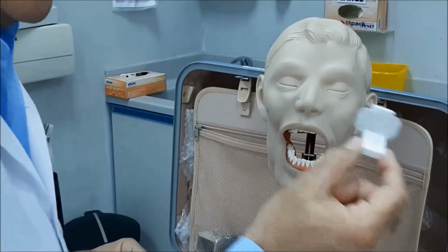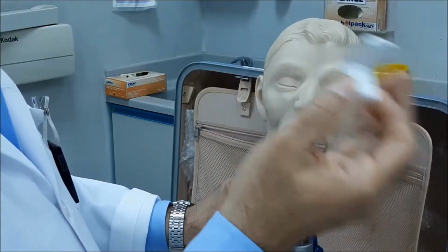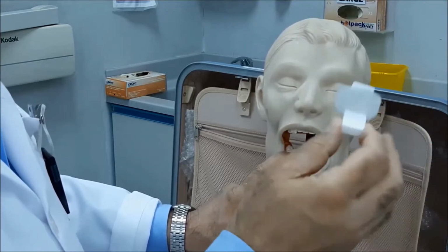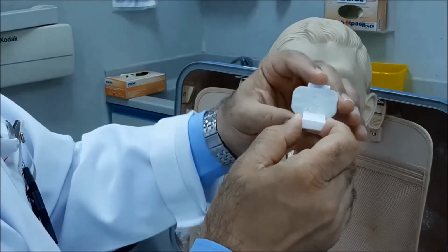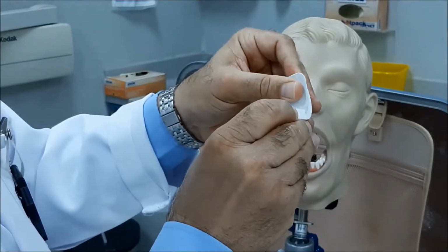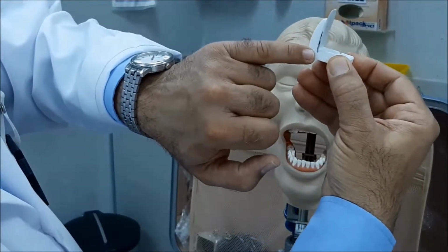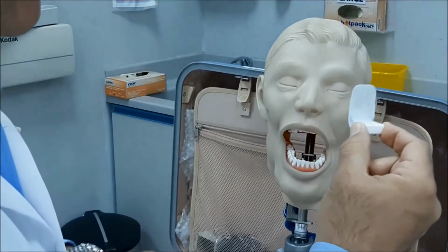Now, if you want to place it inside the patient's mouth, this will fit for any side, any tooth inside the oral cavity. So there is no direction preference. You just put it behind the tooth. You can put it horizontally if you want the posterior teeth, and you can put it also vertically if the teeth to be radiographed will be the anterior ones. So the principle is the same. You just make sure that the film is inserted all the way down into this slot so that it would be supported in place.